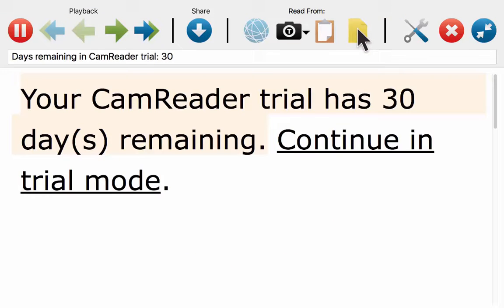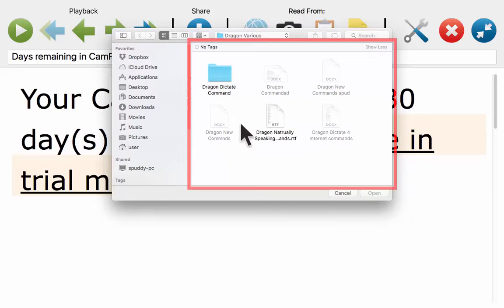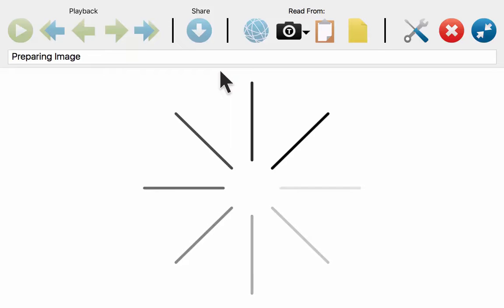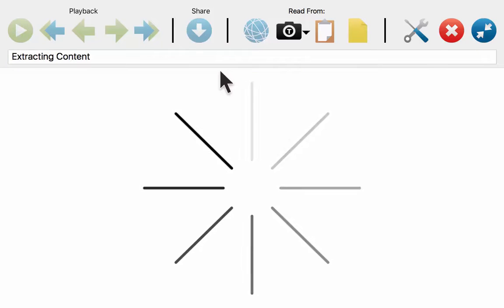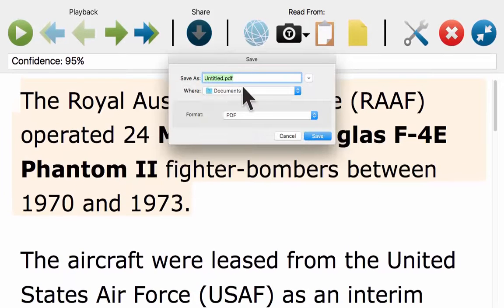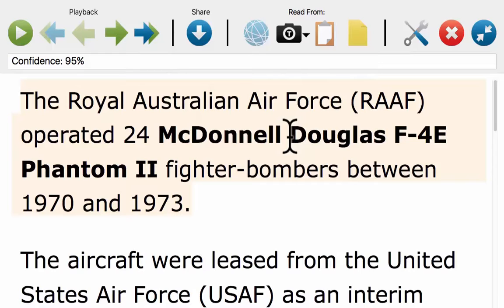I've also got a Read from File option. Because it's a 30-day trial I'll press Continue in Trial Mode. It asks you to find a document to convert — I think I've got a PDF in my documents, so I'll open that. Now it's using OCR to convert the PDF into a standard text format, which then enables you to read it back — especially useful if you're working with a lot of articles. Once converted, I can click Share and save it as a rich text format. It's a pretty good add-on, definitely worth a look.